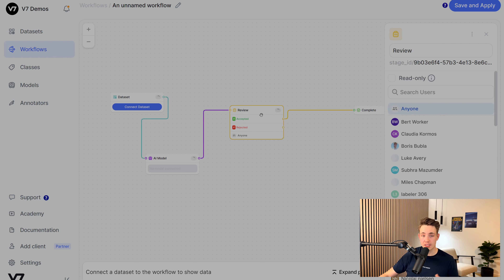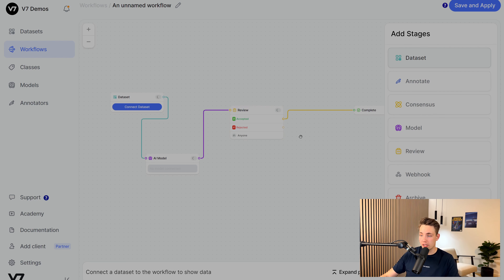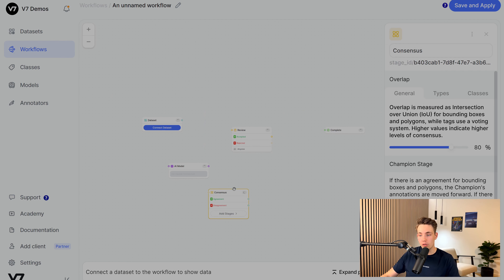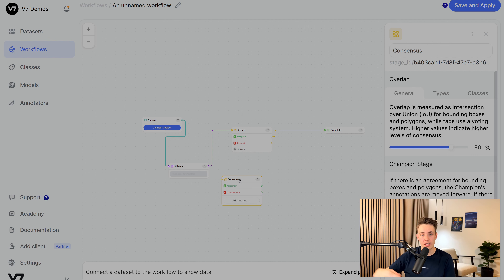If labels are reviewed and accepted, you can throw them into another stage where more advanced senior pathologists do a further review. Only if they accept them do the images go into the complete dataset — because there's a lot of variation in how pathologists label these images, so it's important to have these review stages. You can also set up a consensus stage where different people label images independently. It checks the intersection over union — if the labels match above a threshold value, they agree and the label gets accepted and thrown into the review stage. If it's accepted there, it goes to the complete dataset.